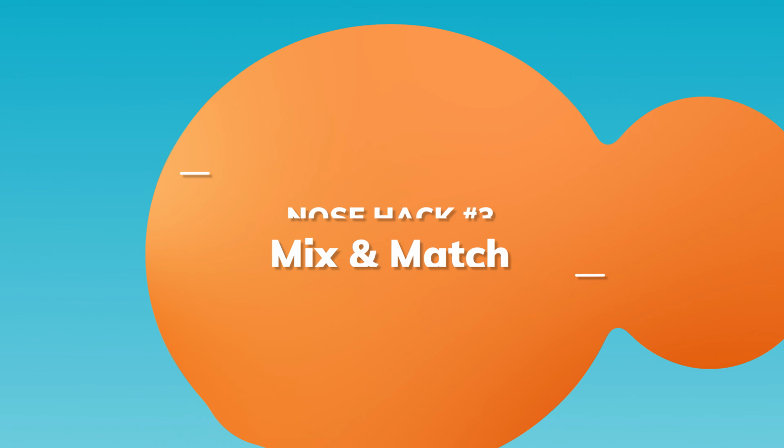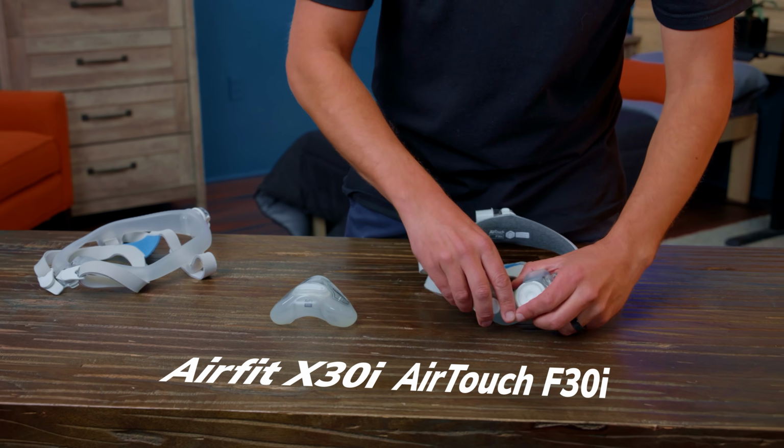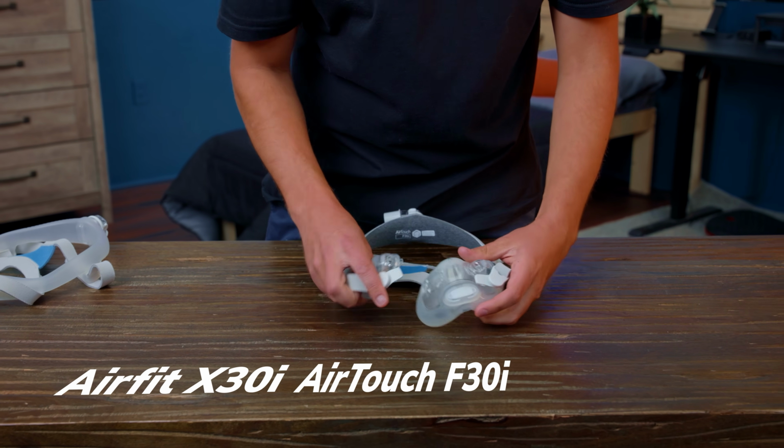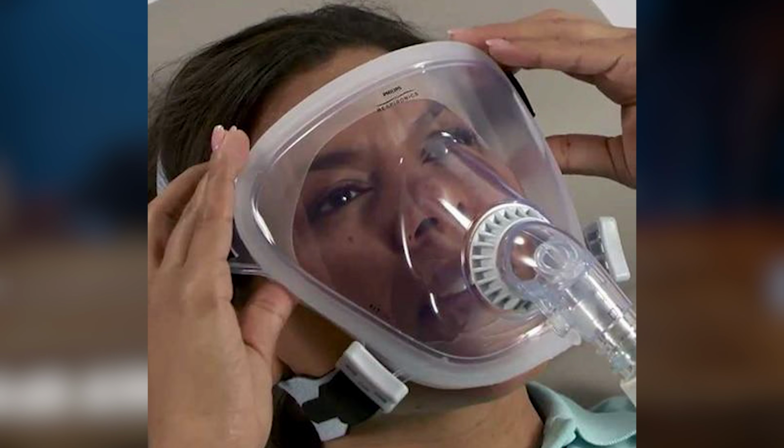Sometimes the problem is that you need a larger cushion for your nose, but you don't want the larger headgear because it makes the cushion sit awkwardly on your face and your nose. If that's you, try mixing medium-sized headgear with a large-sized cushion. It might just fix all of your problems. At the extreme end, take a look at the Philips FitLife Total Face Mask.